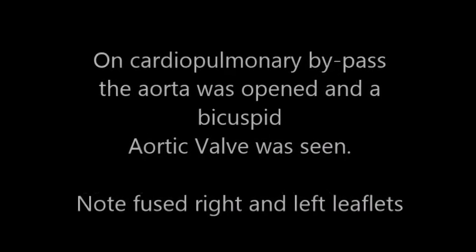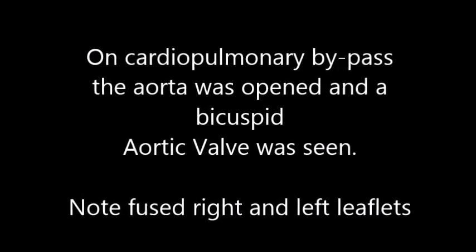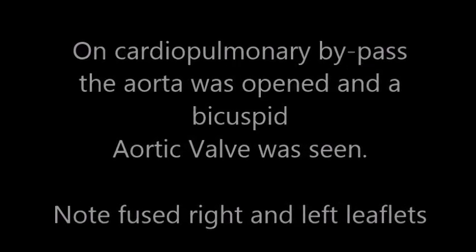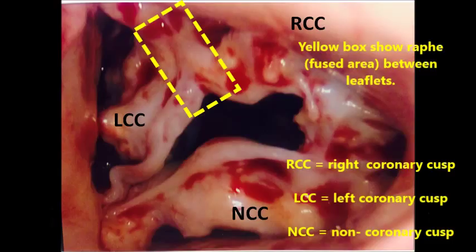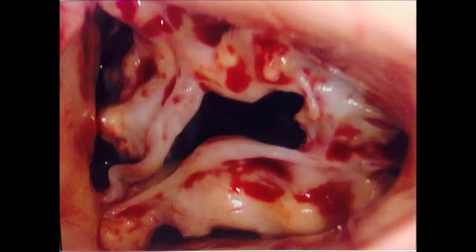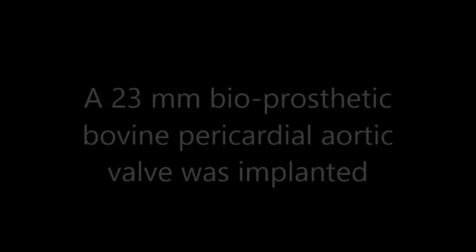On cardiopulmonary bypass, the aorta was opened and a bicuspid aortic valve was confirmed. Note the fused left coronary cusp and right coronary cusp highlighted in the yellow box. Restricted closing of the valve was also causing severe aortic insufficiency.